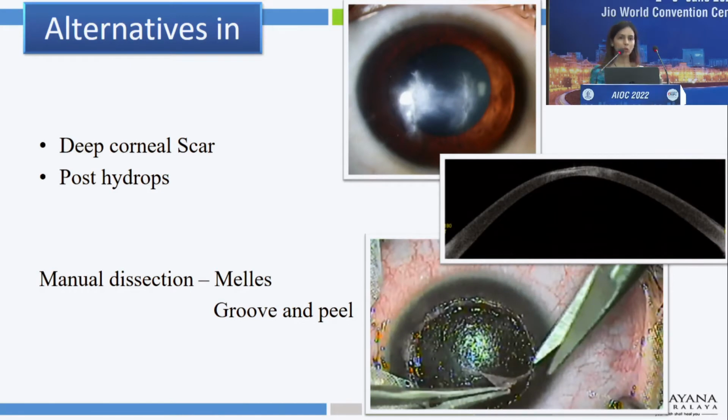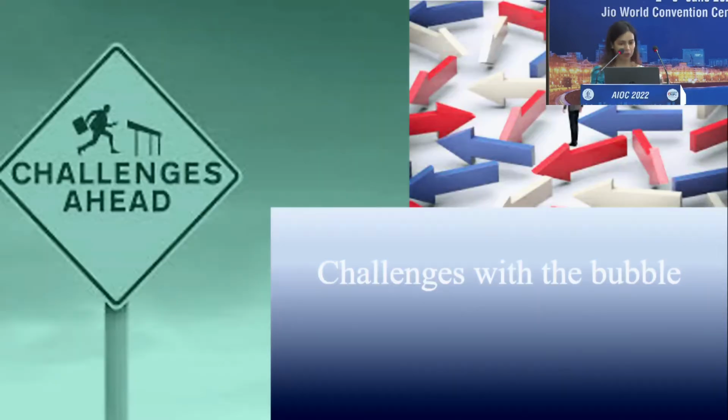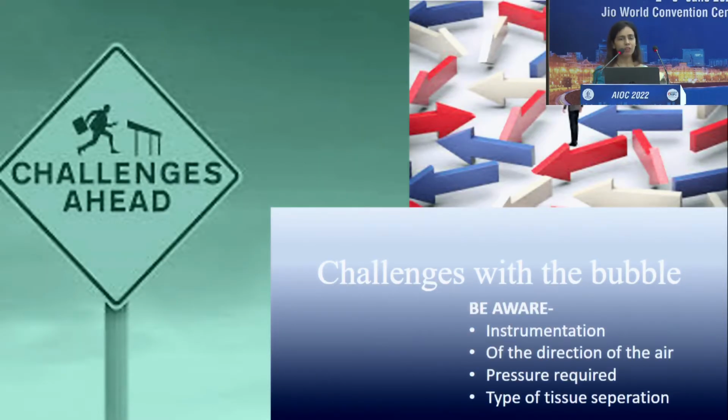Now, what are our alternatives? And this will be taken in detail by our next speakers, but just because we have a deep scar does not mean that you can't go ahead with the DALK. This is still possible even in a post-hydrops scar. So a lot of people are very worried about the bubble and challenges with the bubble. So just a few things that you need to keep in mind.